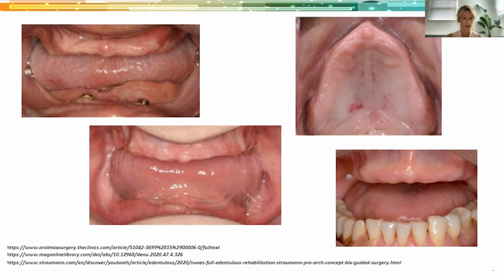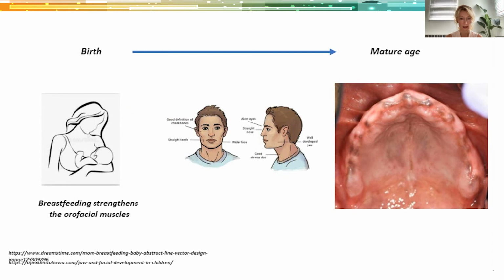And we see these patients every day. We see the big tongue, and the maxilla is resorbed quite a bit. Even if we find a space to place implants, we just want to be more mindful of how we angle those implants so our restorations have a wider arch. And this is basically the most we can do nowadays with today's available techniques.